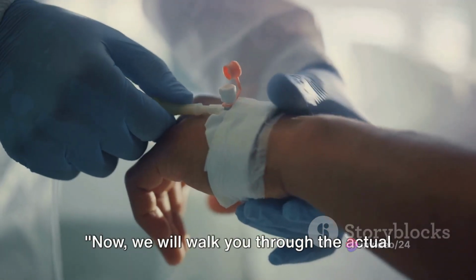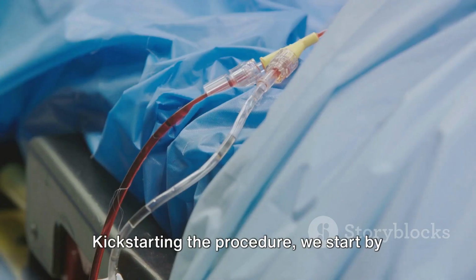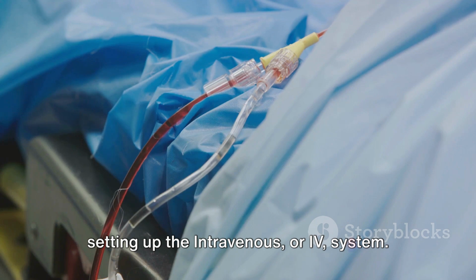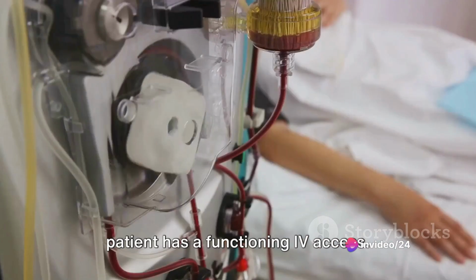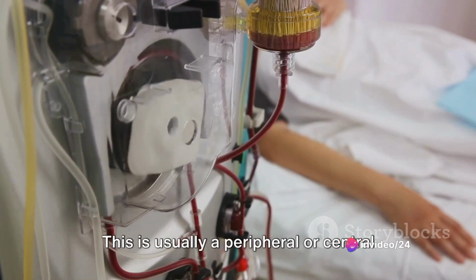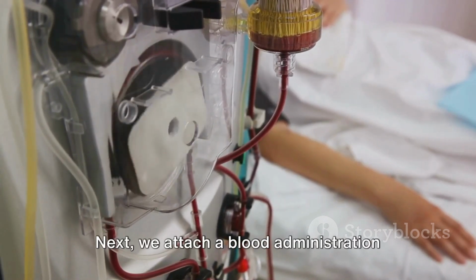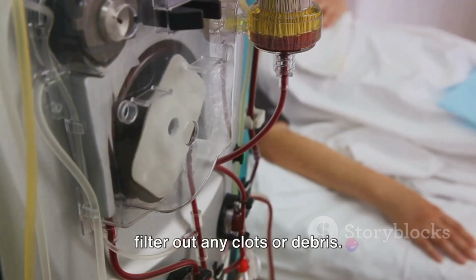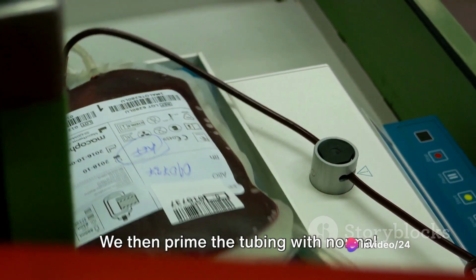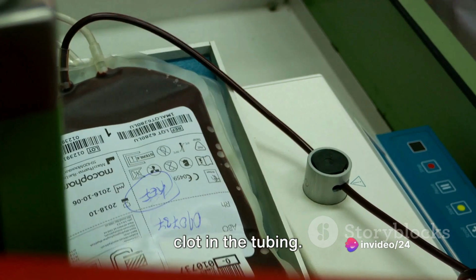Now we will walk you through the actual transfusion process. Kickstarting the procedure, we start by setting up the intravenous or IV system. The first step is to ensure that the patient has a functioning IV access. This is usually a peripheral or central venous catheter. Next, we attach a blood administration set, which is a special tubing designed to filter out any clots or debris. We then prime the tubing with normal saline to ensure that the blood doesn't clot in the tubing.